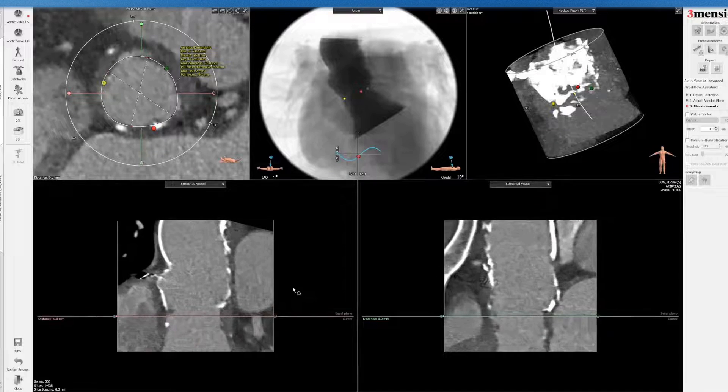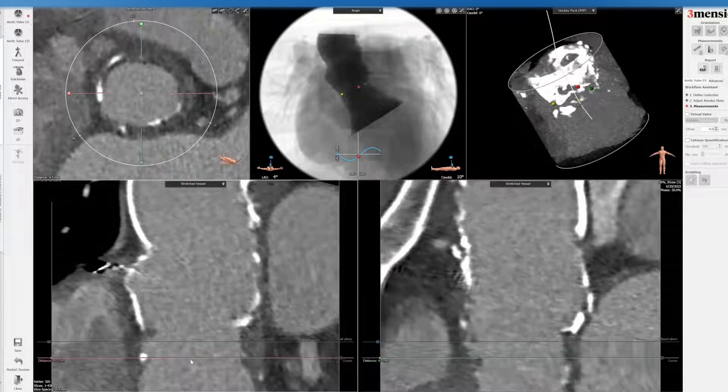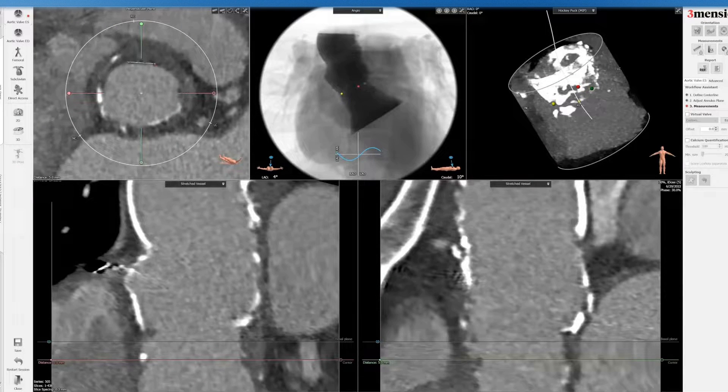I'm going to crop this to make it a little more zoomed in and go into the LVOT measurement. You can see here — similar in terms of my measurement — I tried to stay within the calcium on the inside, because otherwise the area will be overestimated and you might inadvertently oversize too much in terms of the LVOT.